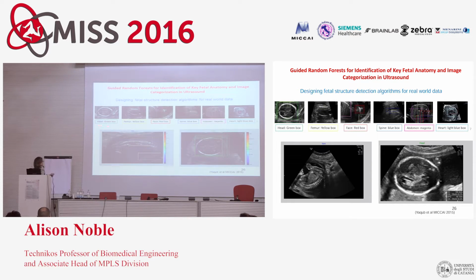These are the ones that a sonographer would acquire, and in fetal ultrasound, because the fetus moves, you don't have these taken in an order, so that's why you have to go through the annotation process if you want to look at them later. You take measurements on the head, the femur, the face, you look at the spine, you measure on the abdomen, and you also do a heart. With those classes, you can then design an algorithm, and this particular algorithm uses thousands of real-world data to do this.